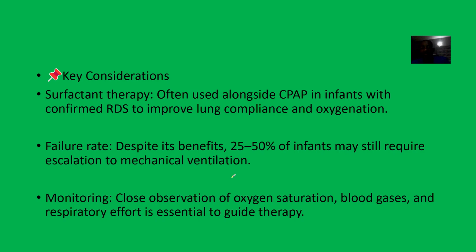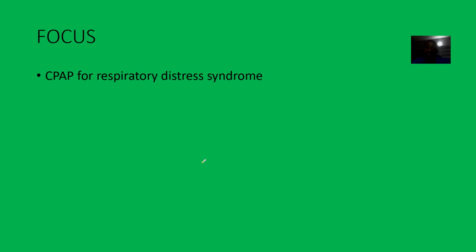As for failure rate, despite its benefit, 25 to 50% of infants may still require what? Mechanical ventilation. So close observation of oxygen saturation, blood gases, and respiratory efforts should guide how you are using it and how you are adjusting it.